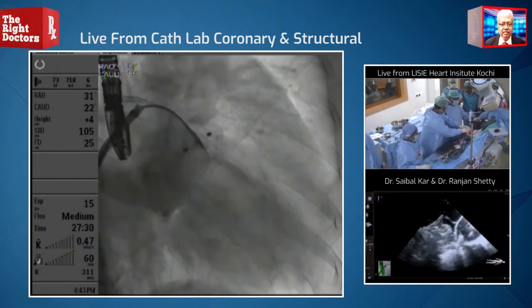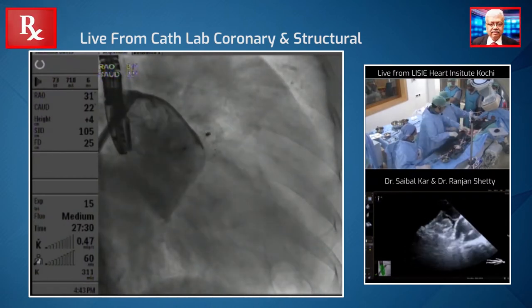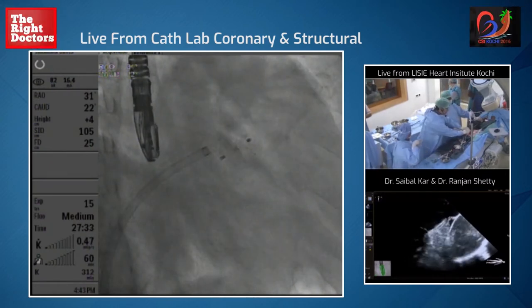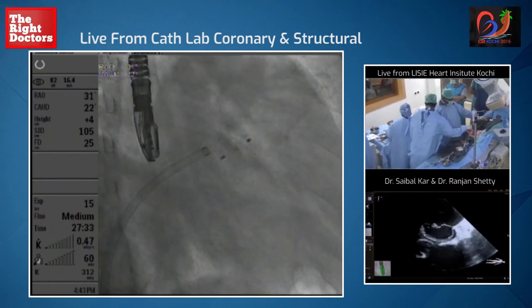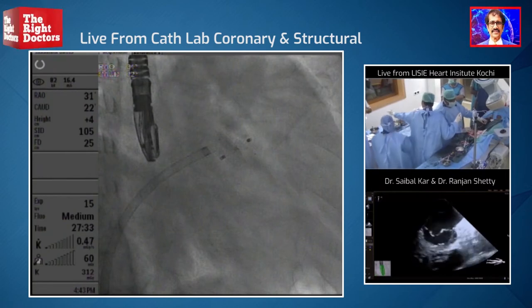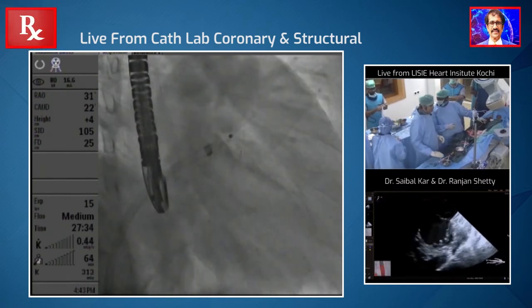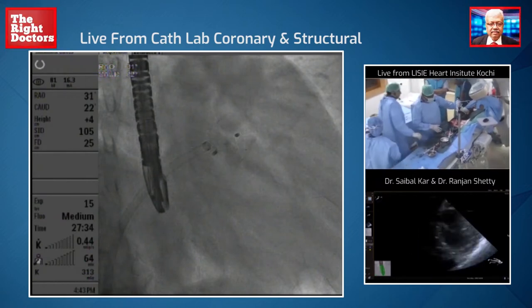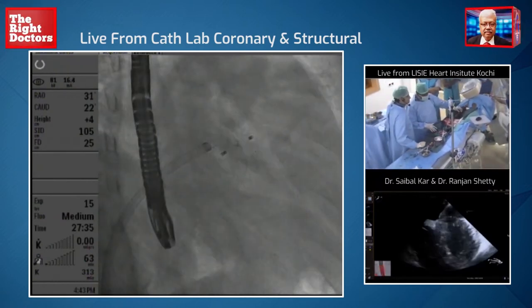Let's close the ASD. We're going to come here and close the ASD with the same device, same sheath. So now let's go to a short axis of the ASD. Can I see the 30 to 32 device? What size did we measure? 28 — maximum of 28. So we're planning to take 32. We're also planning to close the ASD now.